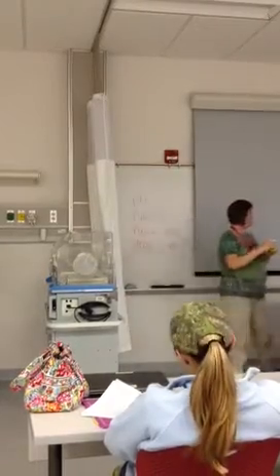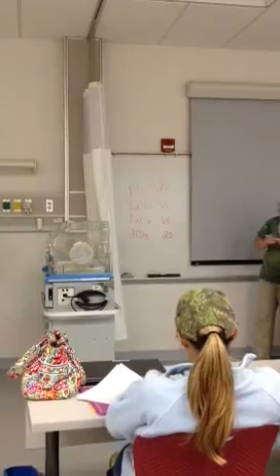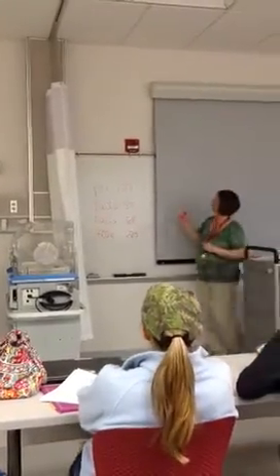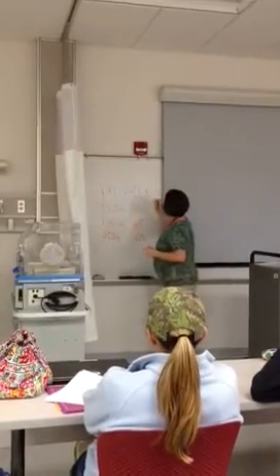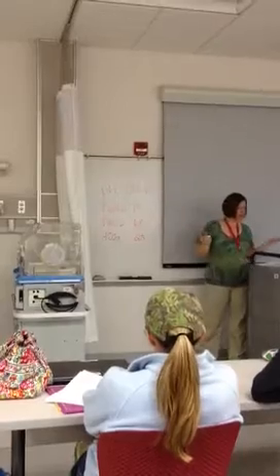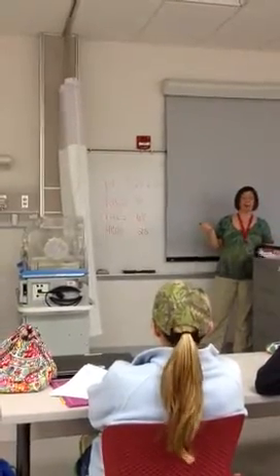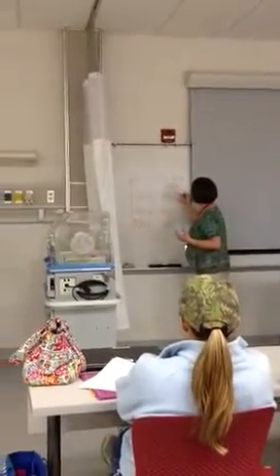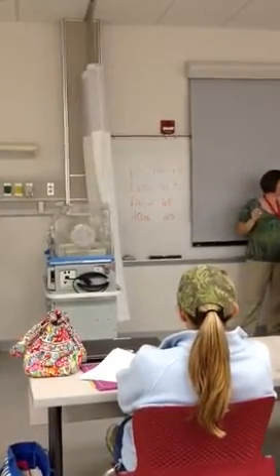Okay. So looking at your chart that I gave you there, what is your pH? 7.28. Acid. We go down, right? It's lower than the normal. So put acid. Your CO2 is 85. So is that out of range, right? Is that high or low? So that's acid again. Your PO2 is 68.